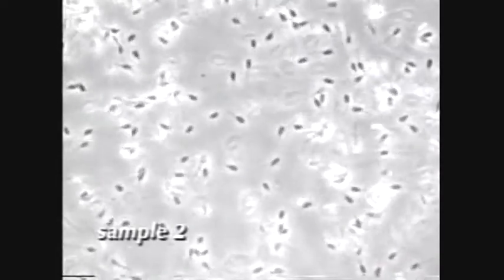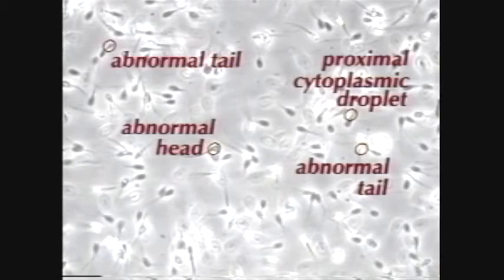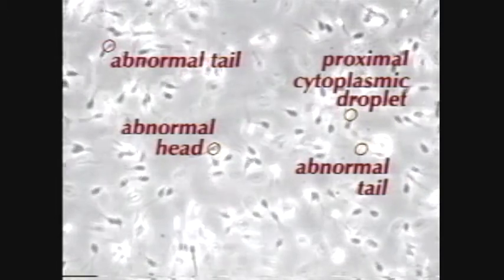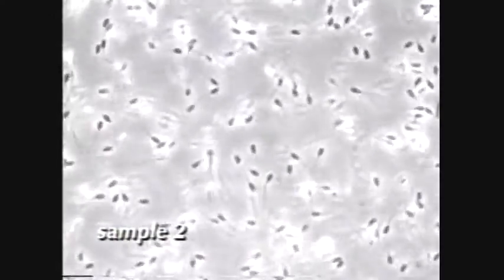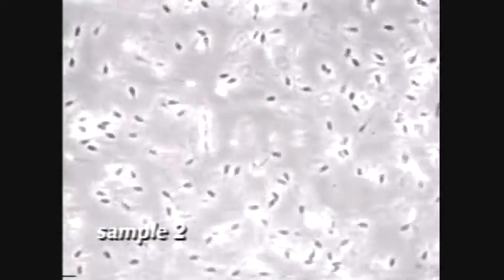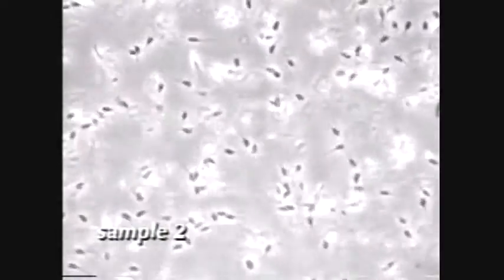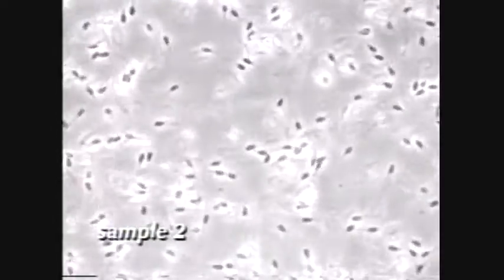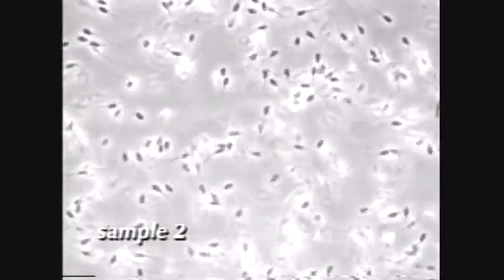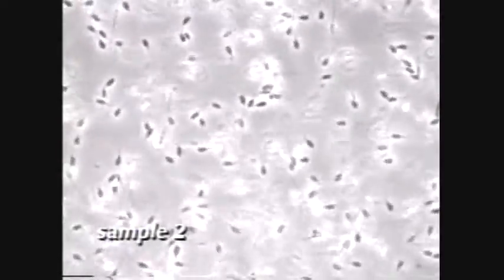Now look for abnormalities of individual sperm cells, such as proximal and distal cytoplasmic droplets, deformed heads, and bent or kinked tails. Sperm cells with these abnormalities are generally considered to be incapable of fertilization, as are non-motile cells. Again, give the sample a score. Next, a composite score should be given, which takes both motility and morphology into account. Sperm cells which are considered non-motile and have a morphological abnormality should not be considered twice, as your goal is to give the sample a score which indicates the percent of normal motile sperm cells.